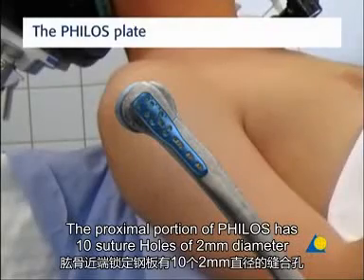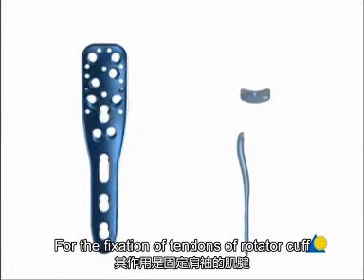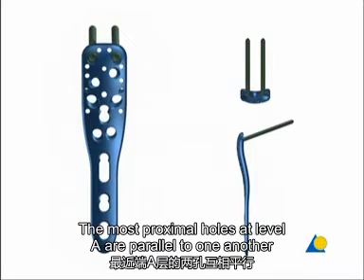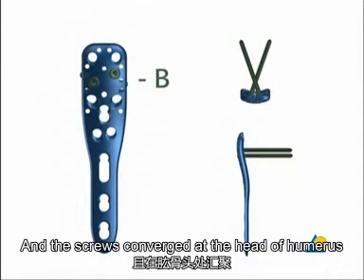The proximal portion of the PHILOS plate has ten suture holes of two millimeters diameter for the fixation of the tendons of the rotator cuff. There are also nine plate holes. The most proximal holes, at level A, are parallel to one another and angle the screws slightly upwards. At the next level, B, the holes are staggered and the screws converge in the head of the humerus.